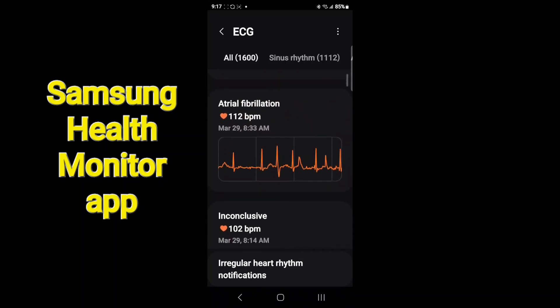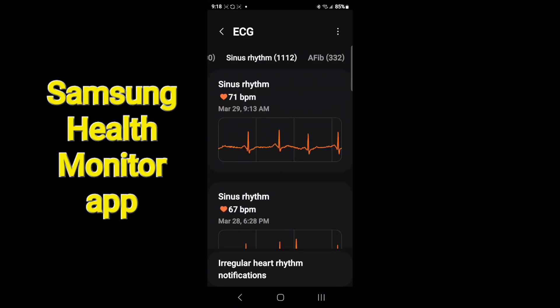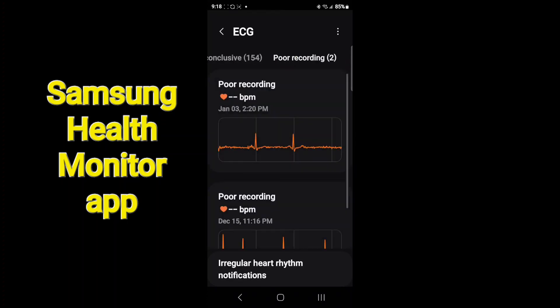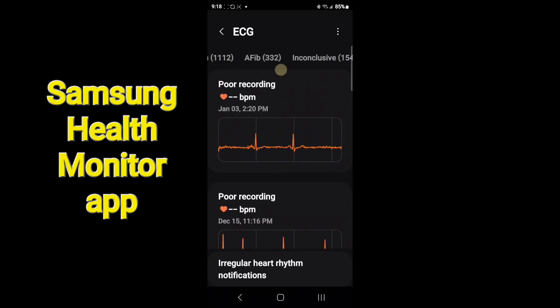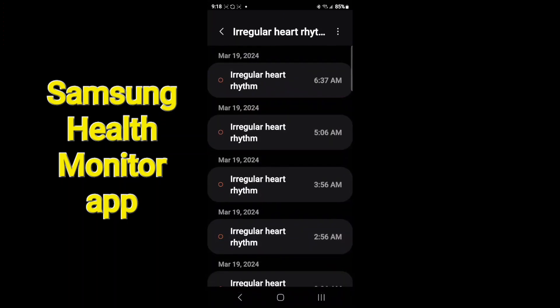Going back, it traces all the issues I've had and you can filter the results. You can pick sinus rhythms — when I'm normal — or filter by A-fib moments, inconclusives, and poor recordings, which might be due to bad finger posture or touch.